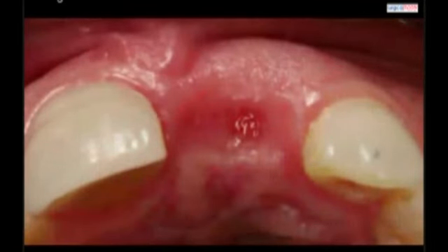And actually, I don't recommend you wait too long, because this extraction site and the bone is going to become very, very dense, actually too dense to your liking. So I would say 4 to 6 weeks later, once the soft tissue is healed, you're ready to go in there with your implant, unless you're doing an immediate, okay?